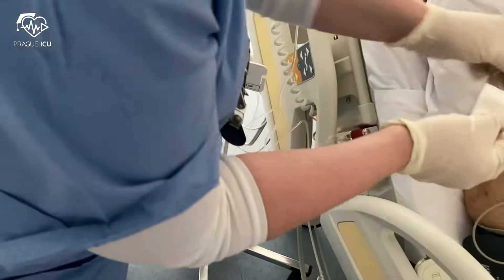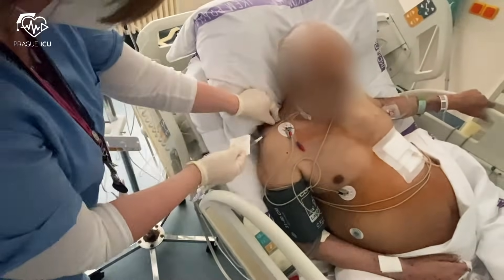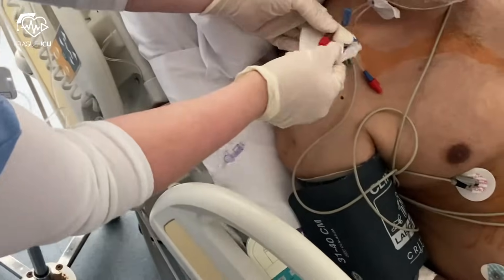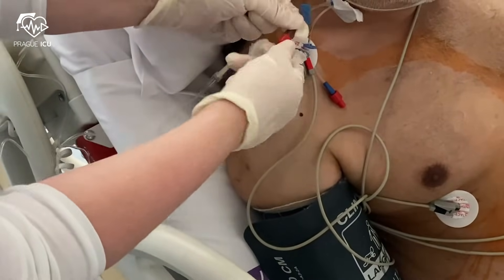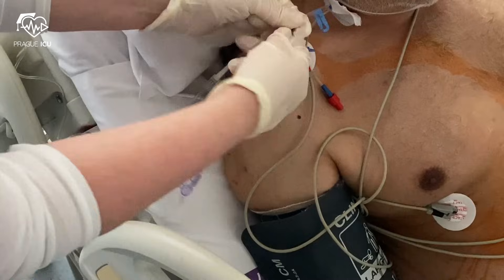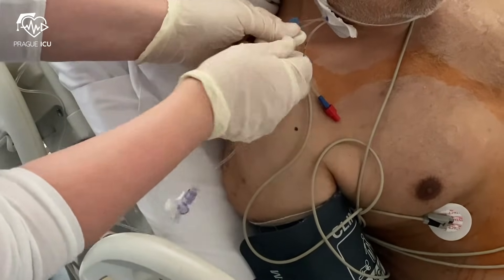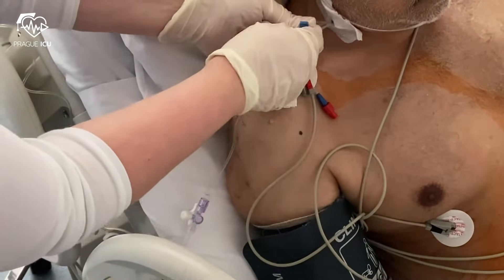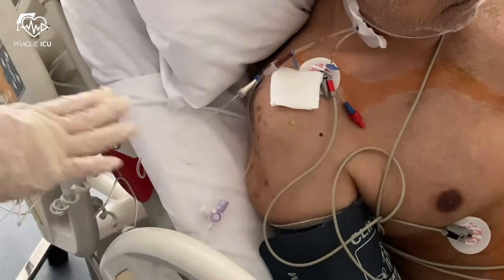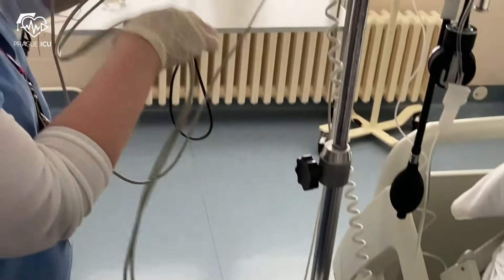Then you connect the pressure tubing tip to the distal lumen of the central venous catheter. Most of the time the distal tip has a brown color. Then connect the transducer cable to the transducer and the monitoring device.